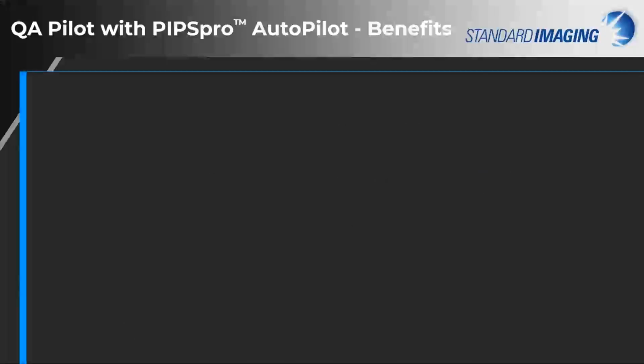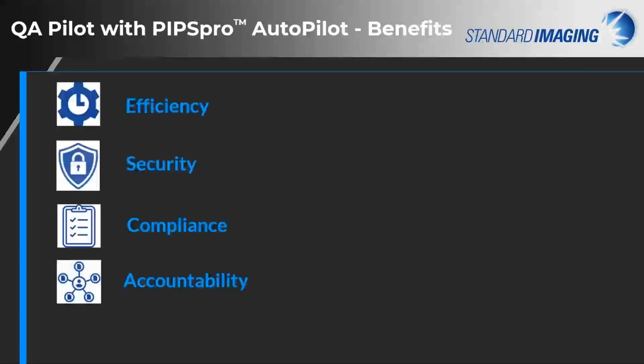So QA Pilot with Pips Pro Autopilot provides all the tools needed to easily increase efficiency, security, compliance, and accountability, which is hugely beneficial to users. It is a truly vendor-neutral solution, which is also a great benefit to users, as it means that they do not need to replace all their QA devices in order to use this powerful QA management software.